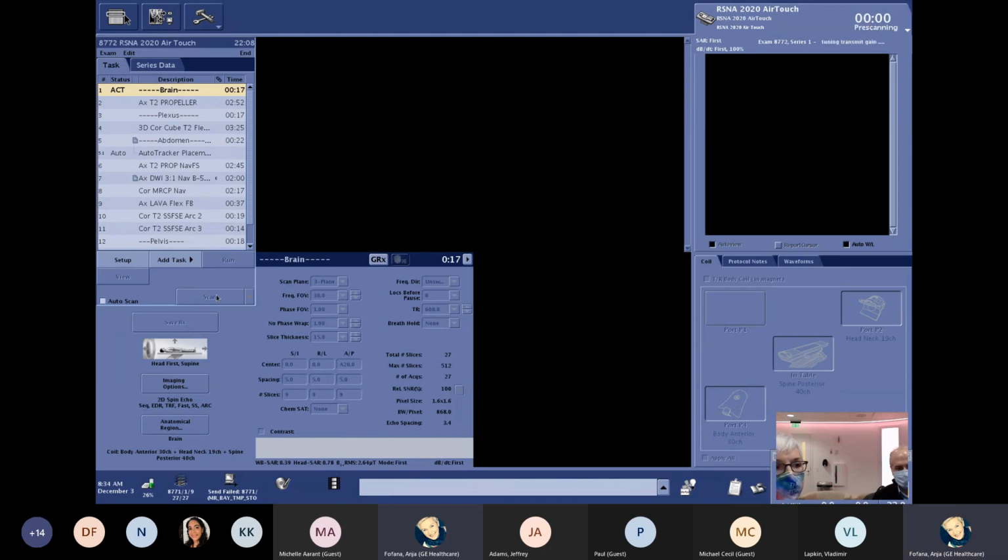The air touch is working as follows. Before we start a scan, we will do a coil calibration. And you can see here in the outer view in the upper right corner, something showing up for 3 seconds saying coil calibration. What we do during that time is we turn off every single channel which the scanner has and all the coil elements in that field of view.